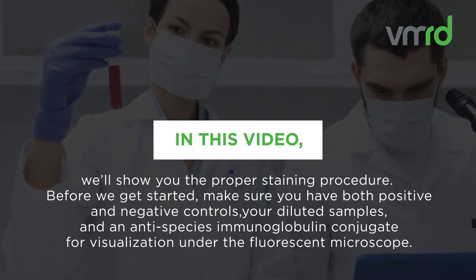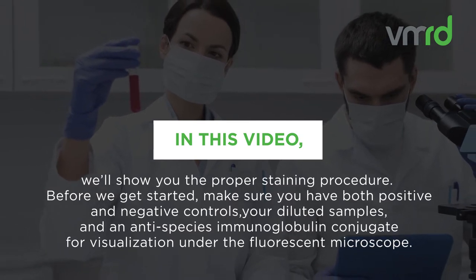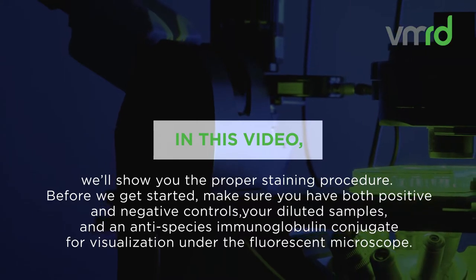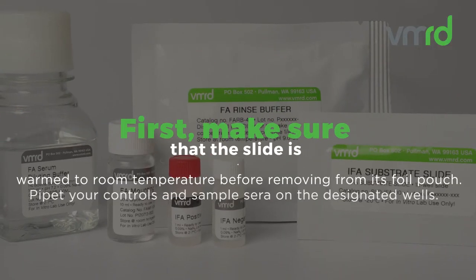Before we get started, make sure you have both positive and negative controls, your diluted samples, and an anti-species immunoglobulin conjugate for visualization under the fluorescent microscope. Additional recommended VMRD products include sample diluting buffer, rinse buffer, and mounting buffer.